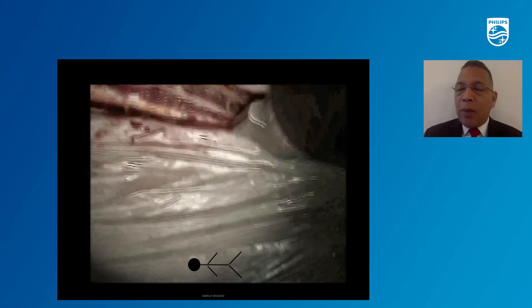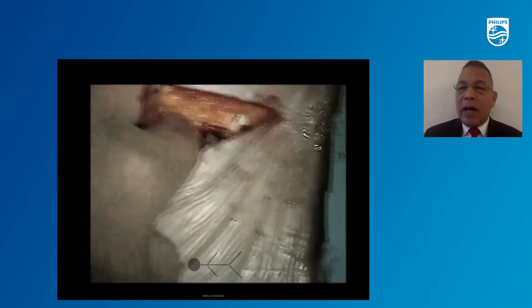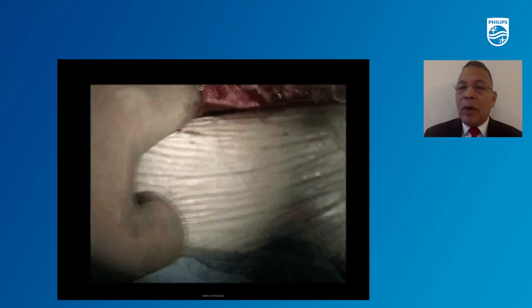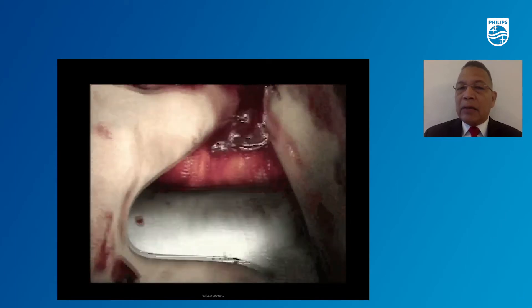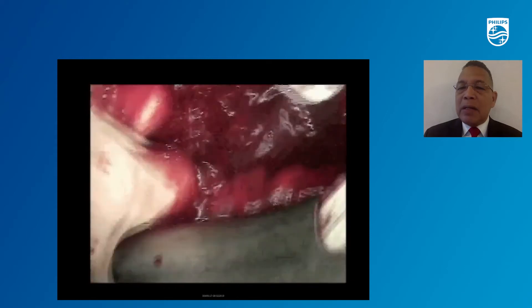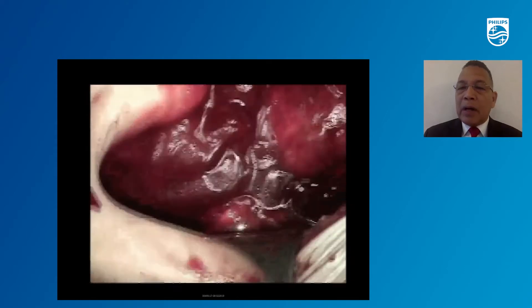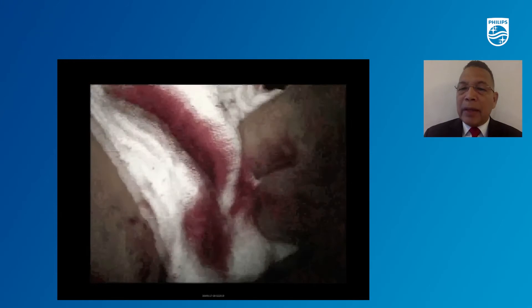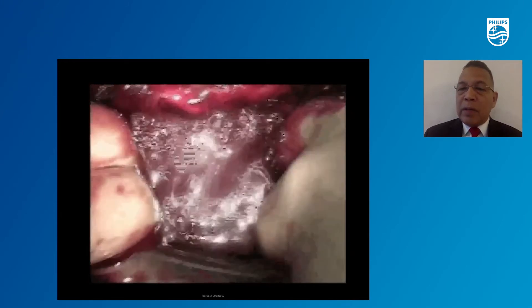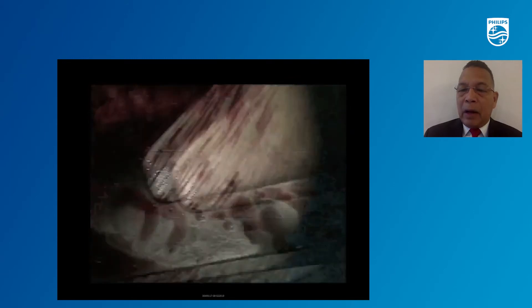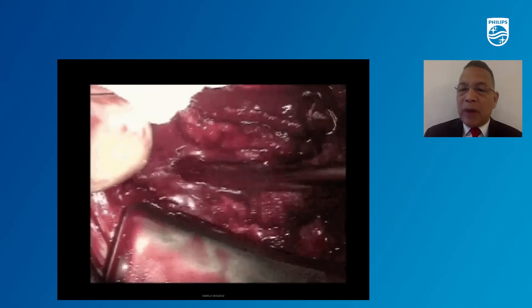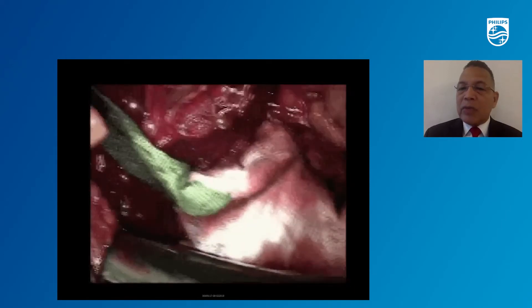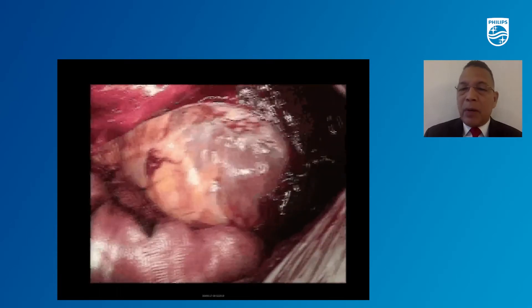A skilled surgeon can open the chest in a matter of minutes, as you can see in this unedited video — the surgeon opening the chest on a patient who is hemodynamically unstable with a tear in the right atrium, opening the pericardium and immediately releasing the tamponade. During pericardiocentesis you cannot release the clot or thrombus located in the heart, and you cannot solve the problem. Therefore, median sternotomy with open pericardium is the best strategy. Most right ventricular or right atrial injuries can be repaired off bypass; complex injuries can be repaired with bypass.